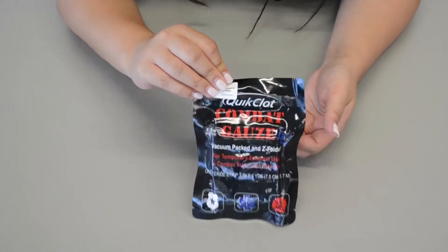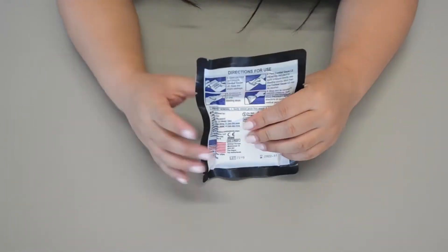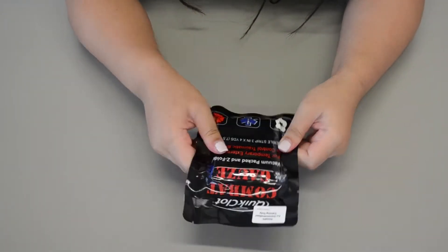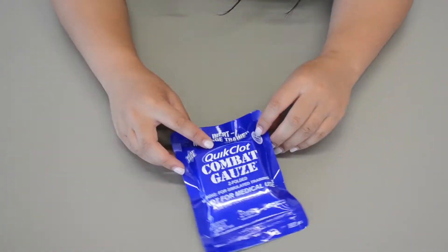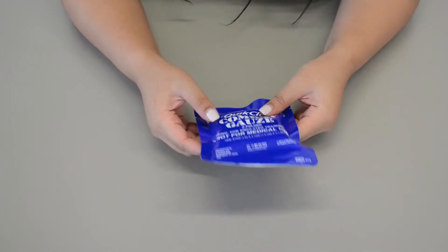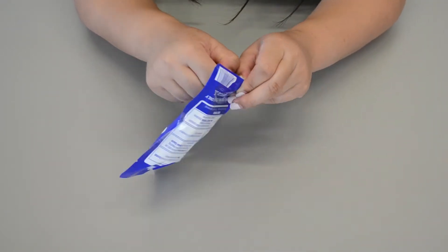So this is going to be our combat gauze. This is what actual packaging looks like — it's usually black, very airtight sealed, and it comes like this on the ambulance. For class, this is going to be our training version. It's blue, it's not airtight, and there's a little zipper right here on the bottom that we can open it.